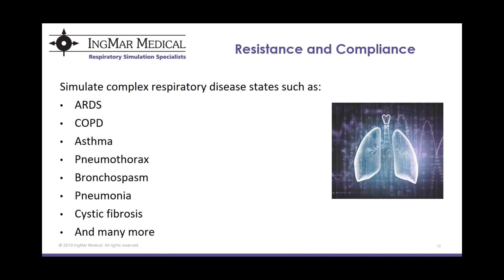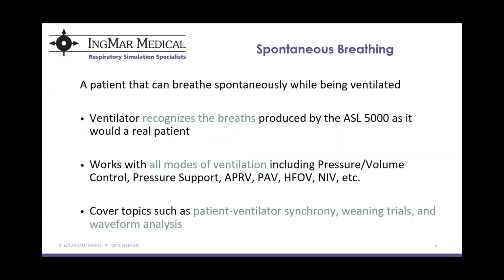So these combinations of resistance and compliance allow us to carefully construct disease state models such as ARDS, COPD, asthma, and many more. But in my opinion, the biggest advantage of adopting the ASL 5000 is the ability to simulate a patient who is breathing spontaneously while being ventilated.